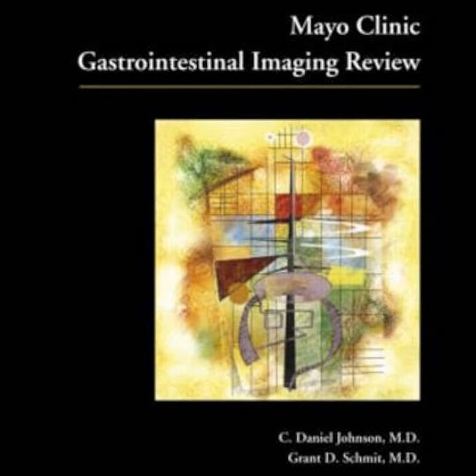Yeah. Because once we know how to properly distend the stomach and spot a diffuse intramural infection, the challenge kind of shifts to isolated masses and ulcers. Right, the lumps and bumps. Exactly. And there's this case in the source material that completely reframes how I view gastric nodules. It describes a 1.5 centimeter round filling defect right in the gastric antrum. The lower part of the stomach. Right. And it has this central umbilication, like a little dimple.